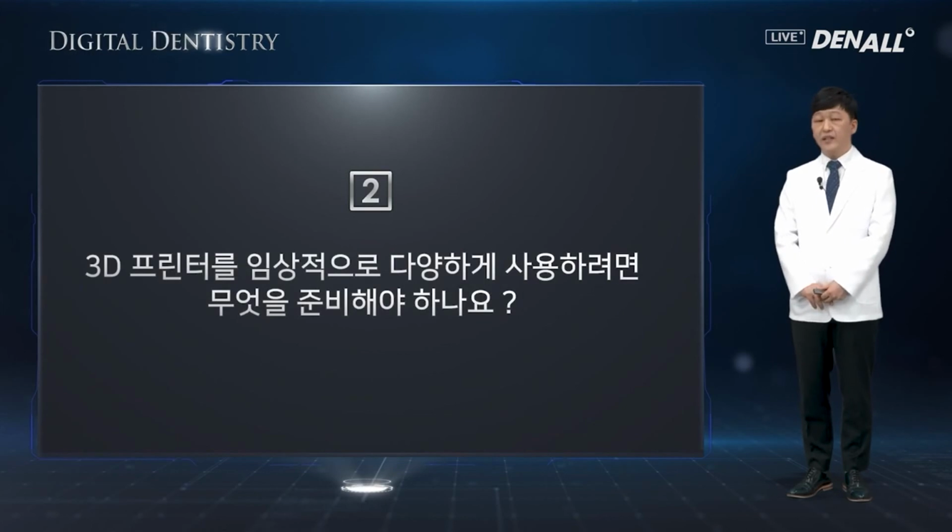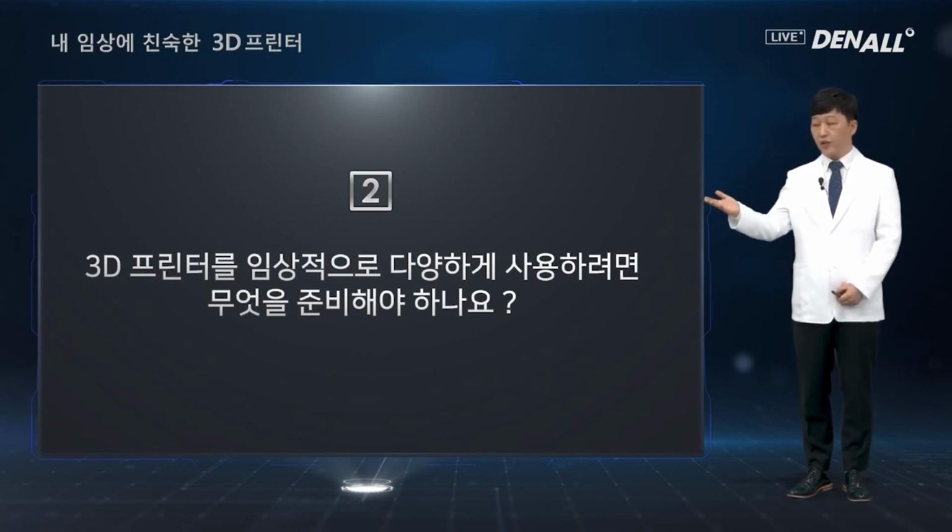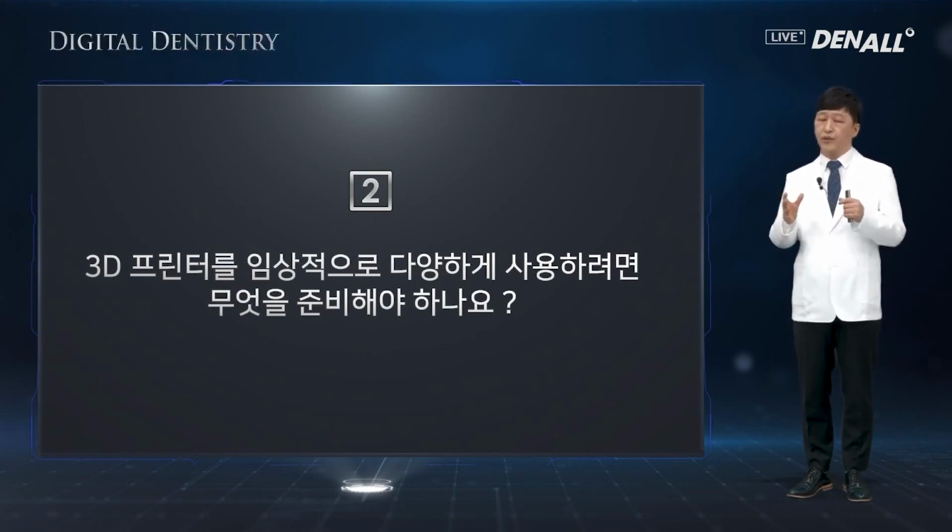The second question, what do I need to prepare to use a 3D printer in various clinical areas? As I showed you just before, in that case, to fabricate a temporary denture, recording base, or an individual tray, you need to have a designing program.